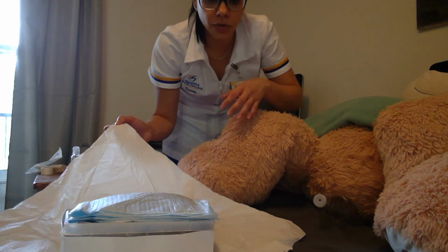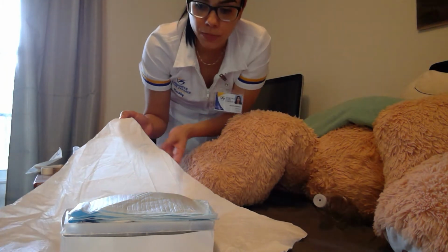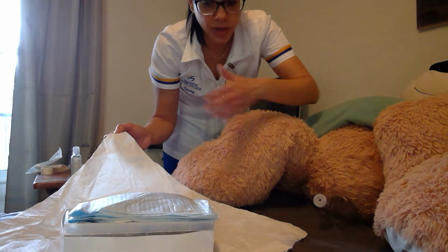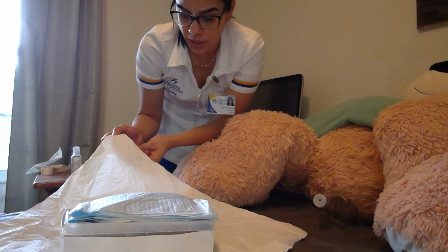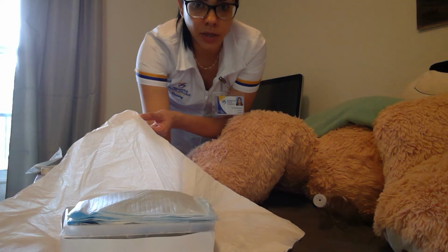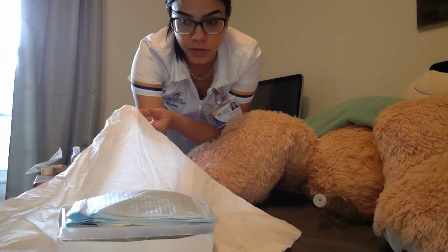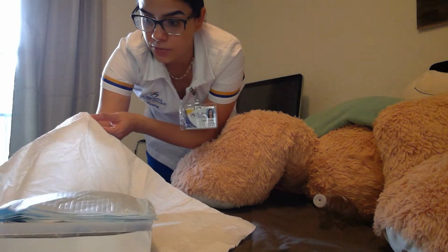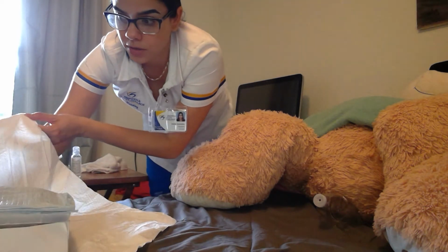Okay, so because I don't have that much space here for this video, I am going to move my tray a little bit down the bed so I can put my drape, and then I will bring it back up. The most important thing is that I'm not touching the inside of my tray with my hands so I don't contaminate. So I'm just moving it down without contaminating.